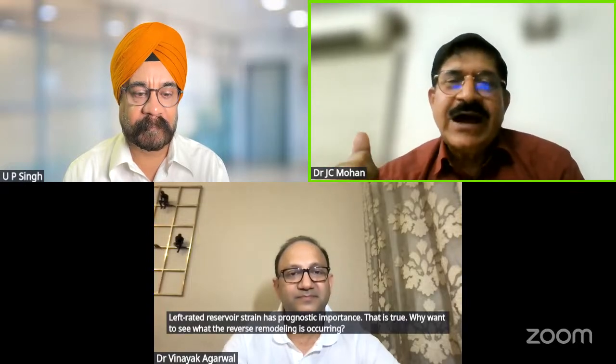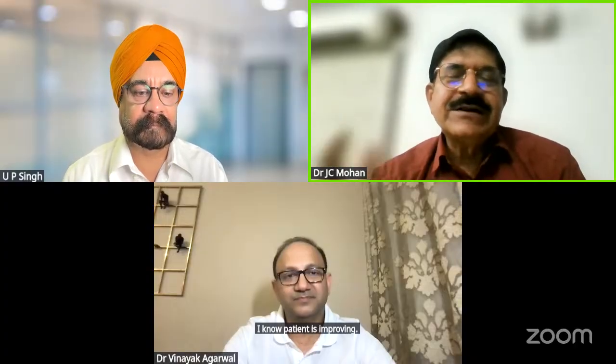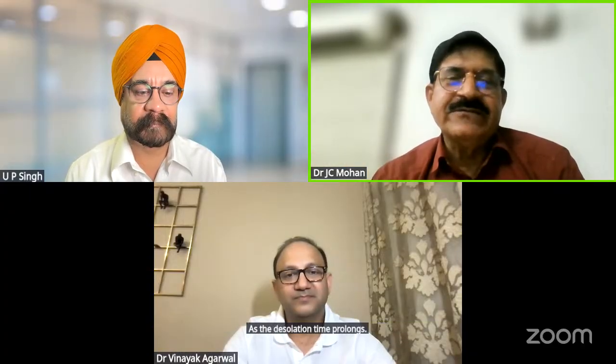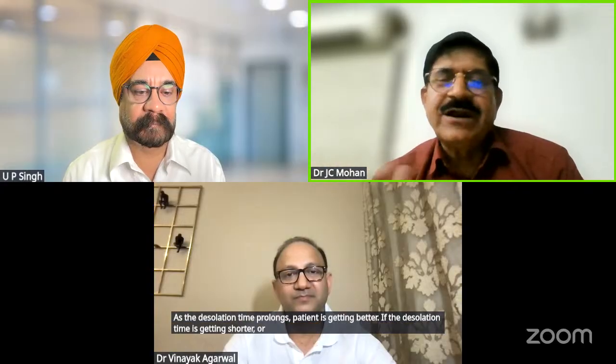Why do we want to see whether reverse remodeling is occurring? The last bulwark is LA strain. If the LA strain starts improving, I know the patient is improving. The third important parameter is similarly deceleration time. As the deceleration time prolongs, the patient is getting better. If the deceleration time is getting shorter or remains the same, the patient is not improving.